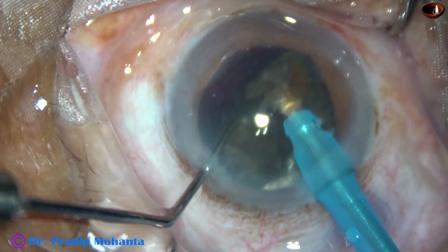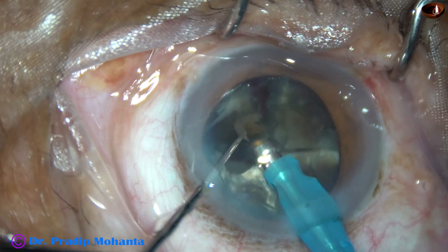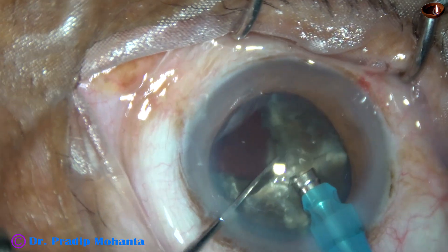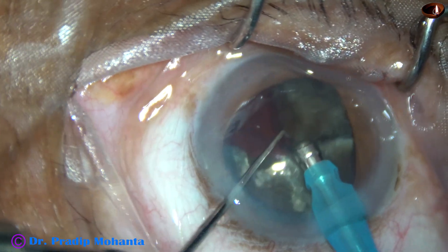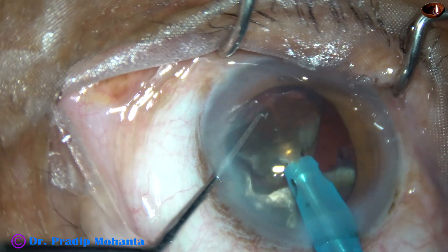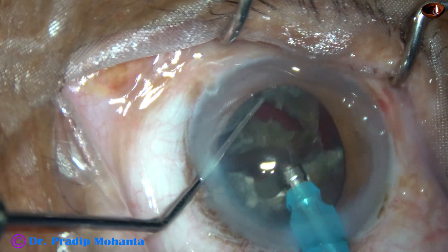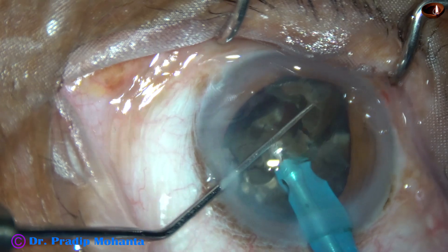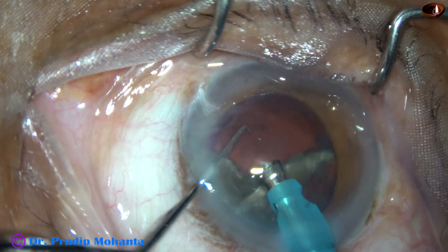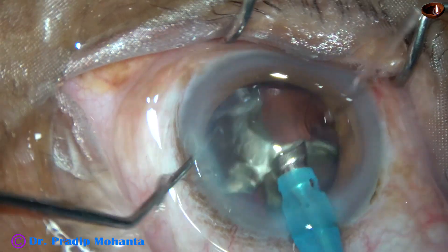See — no nuclear fragment is moving here and there, and it is not coming towards the corneal endothelium. It is not hitting the corneal endothelium at any moment. All the nuclear pieces are being managed within the capsular bag, or at the iris plane, or just below the iris plane. It never comes above the iris plane, and thus the corneal endothelium is nicely protected, even though I have used only hydroxypropylmethylcellulose.